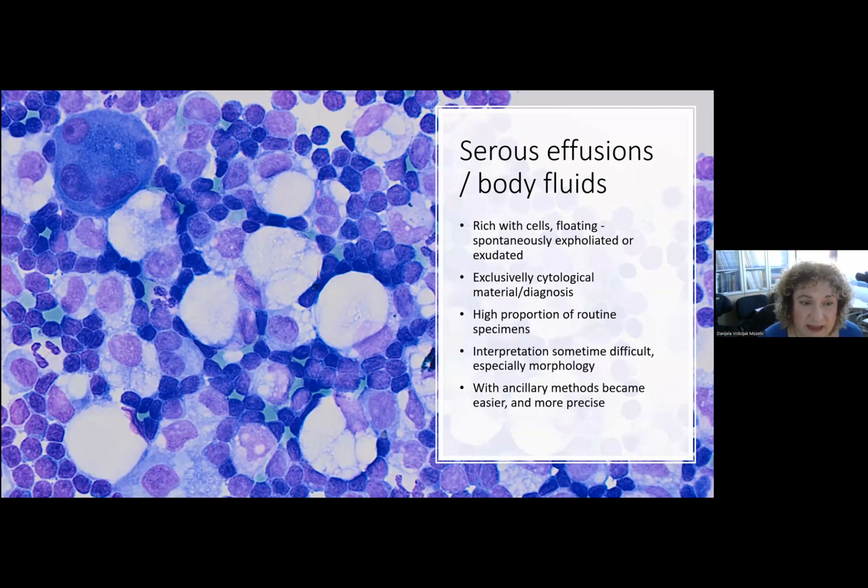We can say that in any cytology lab, serous effusions present a high proportion of the routine specimens. So many cytologists have it on a daily basis on their microscopes. On the other hand, interpretation is sometimes difficult, especially with only morphology, but with ancillary methods, which I will show you, it can become easier and more precise.